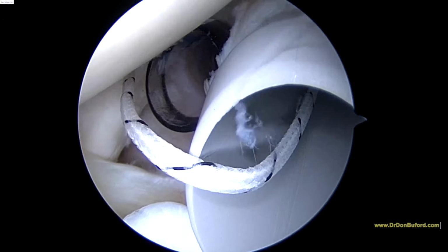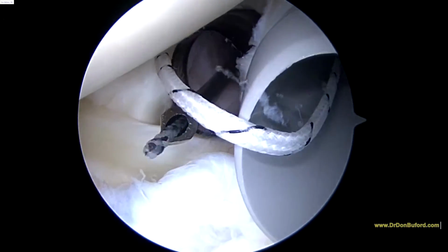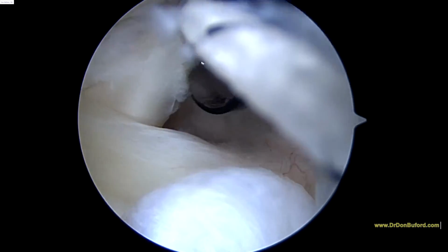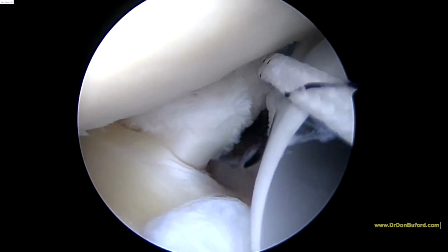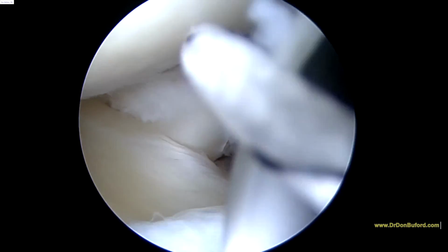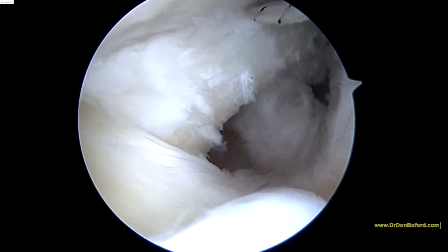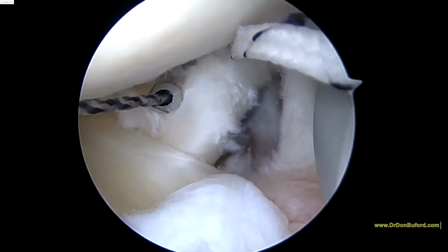We'll take our crescent suture, go through that clear cannula on the left. Here it is right here. It's loaded with a black wire called the super shuttle. There it is there. We'll pull back here. Now with this first one, yeah, your left hand. Right about there. We'll feed that through. We'll show you some more in a minute.